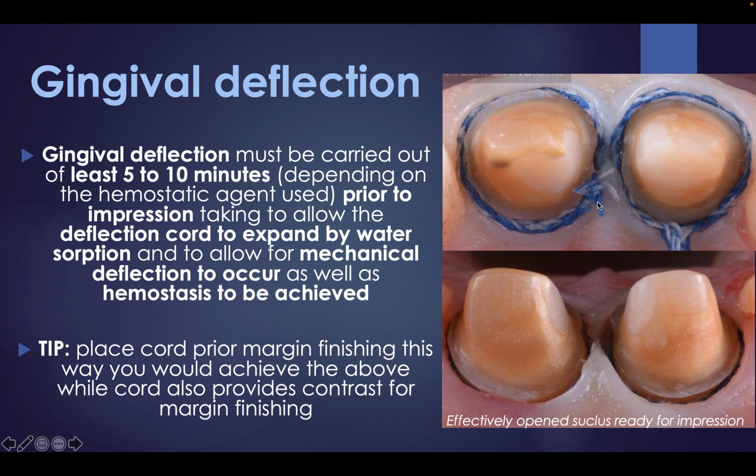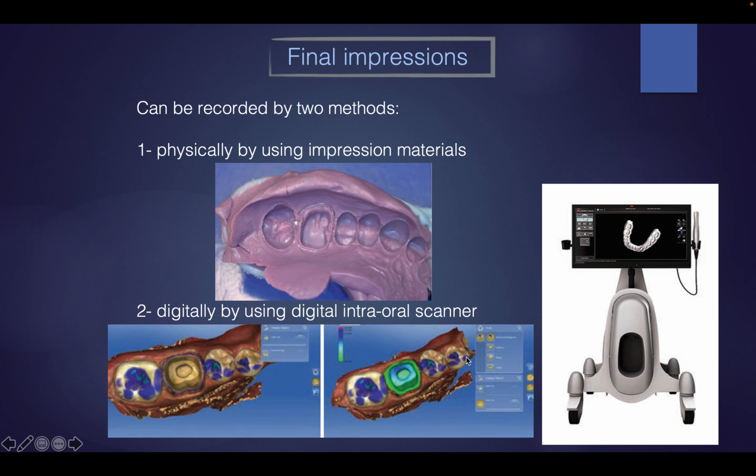When you put the first cord, it will give you some pushing, and you can do the final finishing of your margin. So how to make the impression?